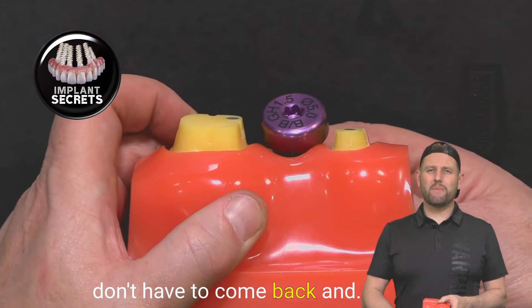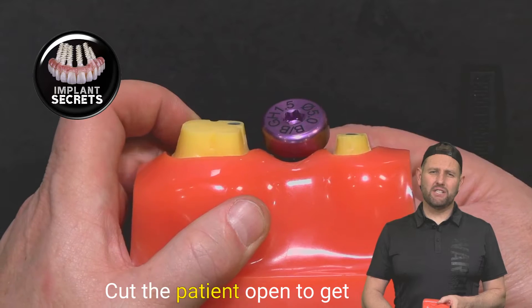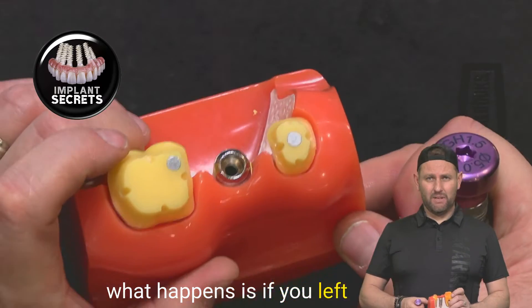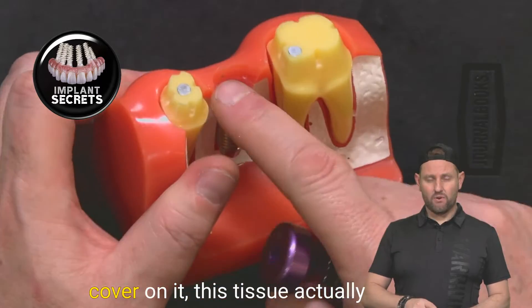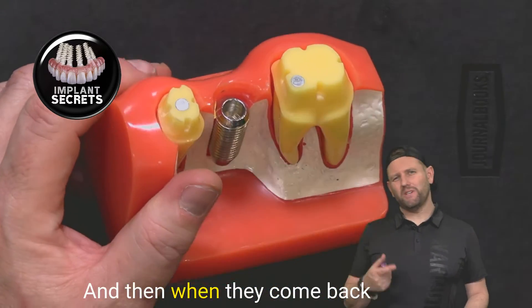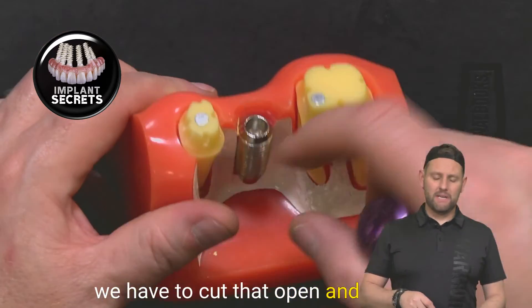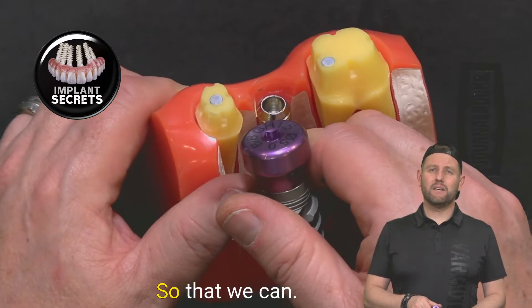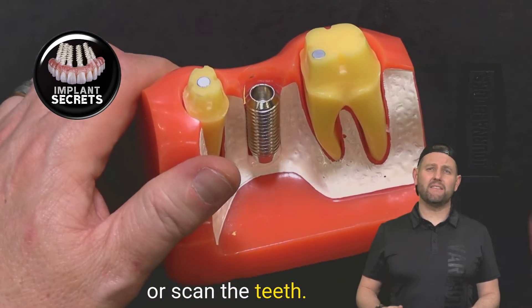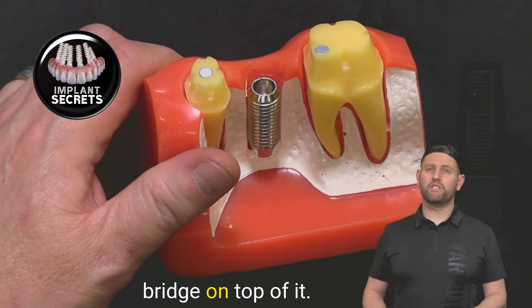That makes it so that you don't have to come back and cut the patient open to get access to the implant. Because if you left it and just put a cover on it, the tissue actually fills in over the top. Then when they come back, we have to cut that open and put a tissue former in so that we can take an impression or scan the teeth later on to build a bridge on top of it.